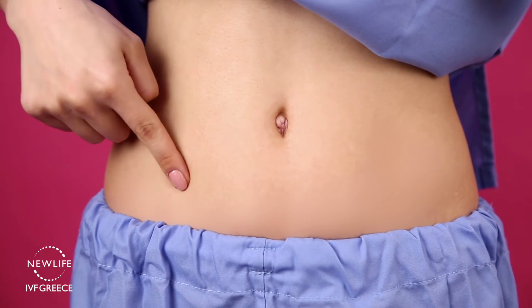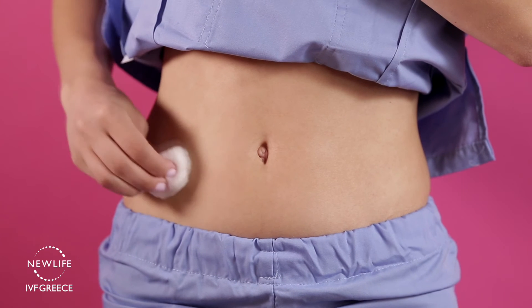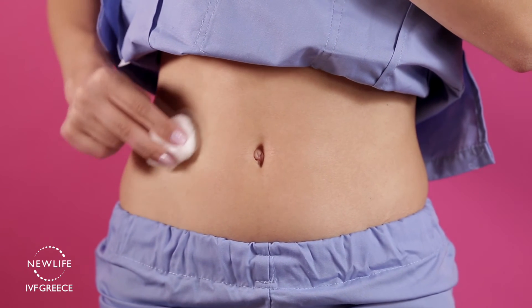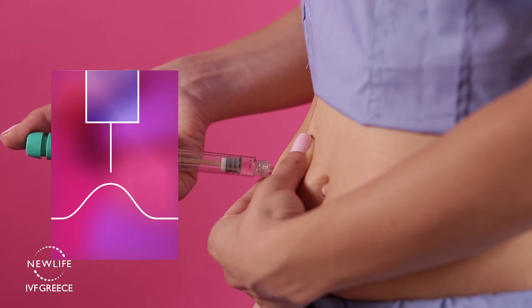After you choose your injection spot, take some gauze soaked in alcohol and thoroughly clean the injection site. With one hand, pinch your folds of skin and insert the needle at a 90 or 45 degree angle.